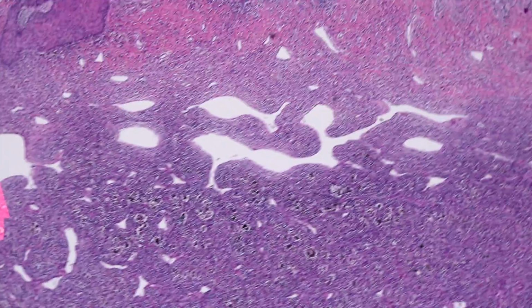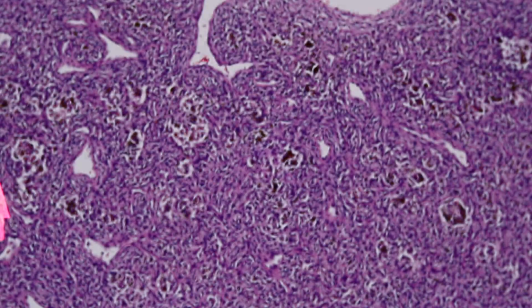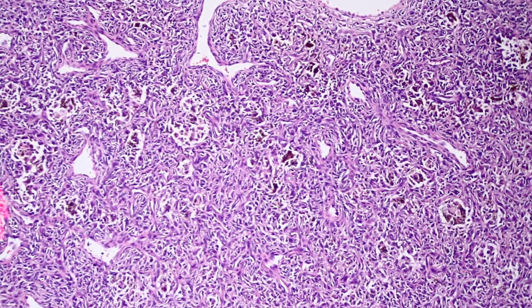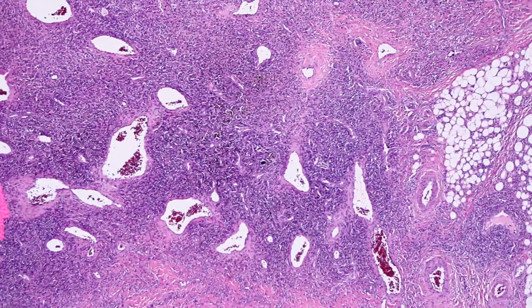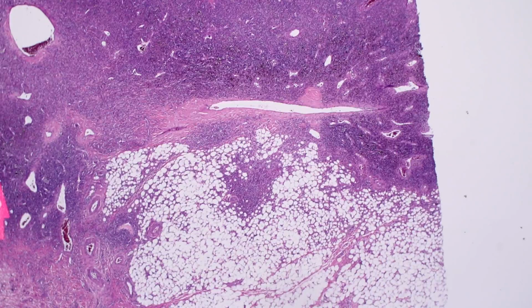Again, really dramatic branching, ectatic staghorn vessels here. Abundant hemosiderin. And then, let me show you the deep edge of this tumor, where it interfaces with the fat. This is why people get concerned also.